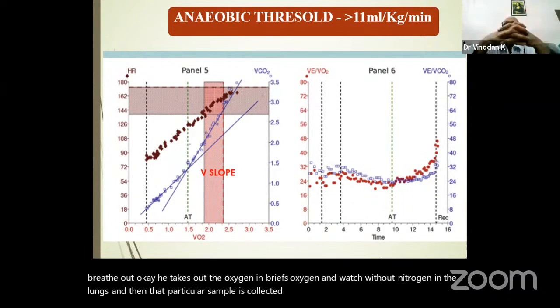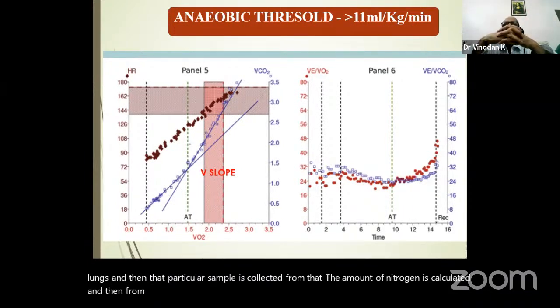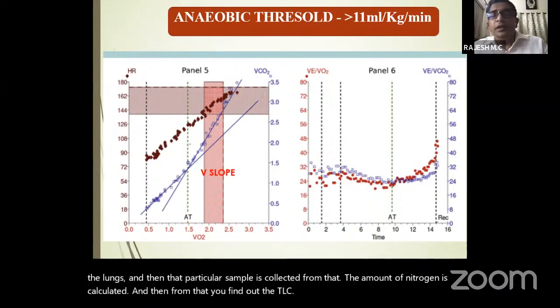From that, the amount of nitrogen is calculated, and from that you find out the TLC.